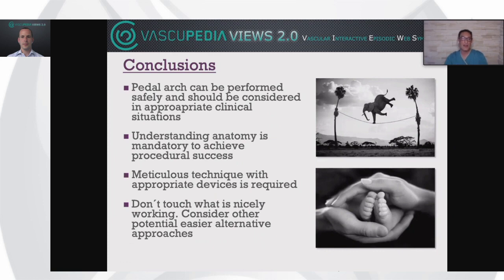So in conclusion, pedal arch intervention can be performed safely and should be considered in appropriate clinical situations. It's really important to be familiar with the anatomy to achieve a nice procedural success. You definitely need to be meticulous and be familiar with the devices, because what is a quite nice and elegant maneuver can become a disaster in case of failure. And don't touch what has nicely worked. If needed, consider other potential easier alternative approaches.